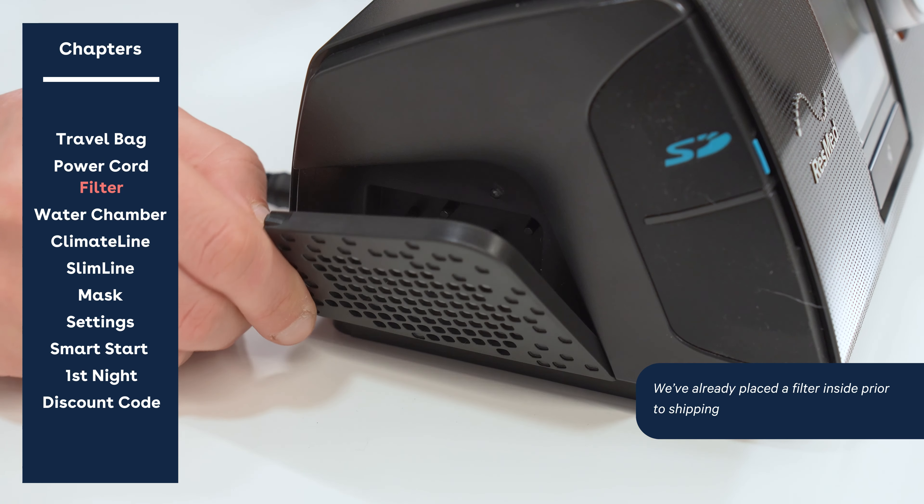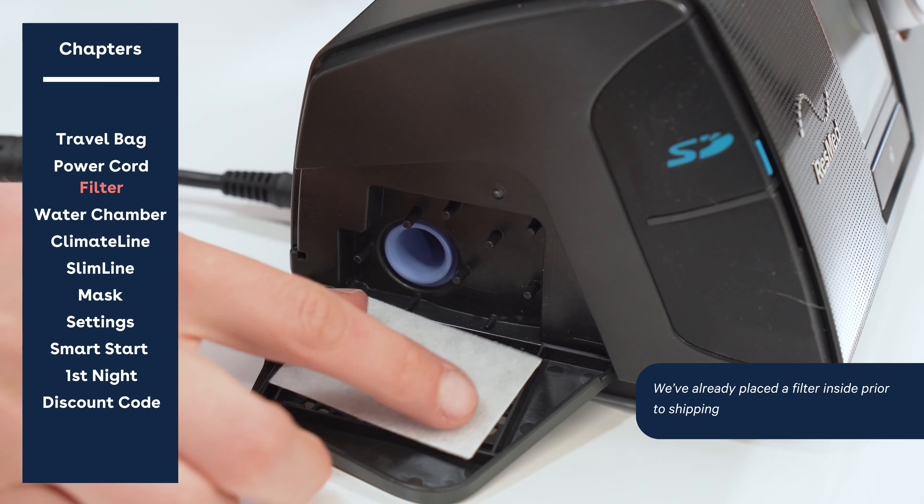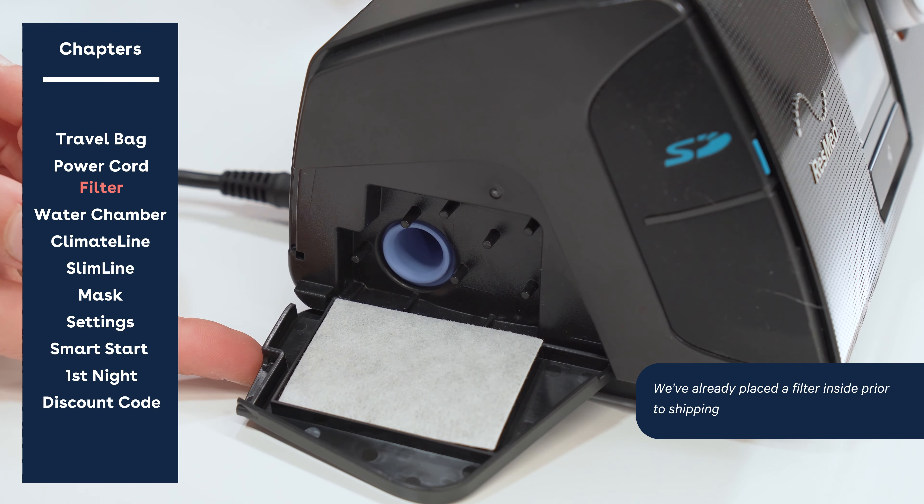Here is your air filter on your device. It will come pre-loaded with one, and you should be changing it out on a monthly basis.